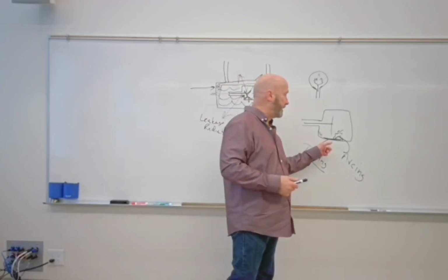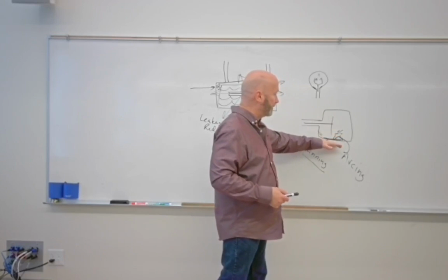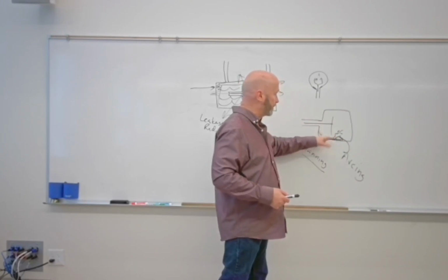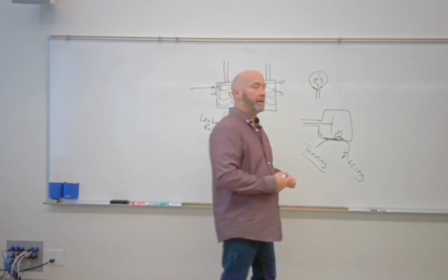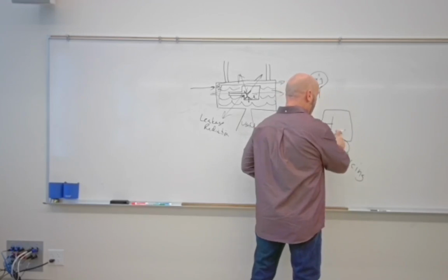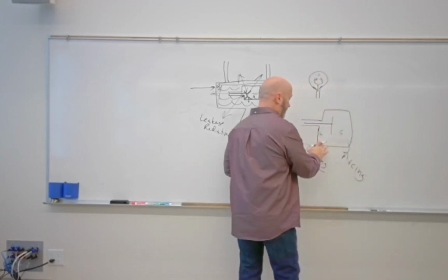If they make the metal envelope where the metal is close enough to the travel of the electrons that it prefers this direction to that direction, you're going to have a problem. Okay? But if they engineer the envelope, maybe they make this distance a little bit further, maybe that's how they overcome it.